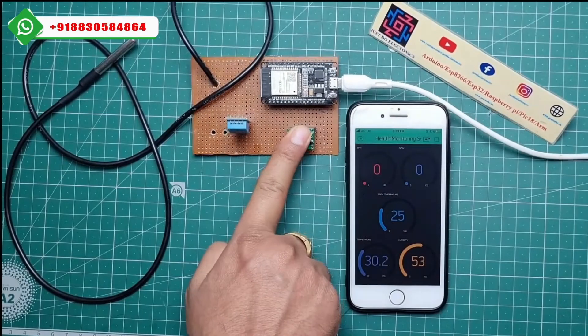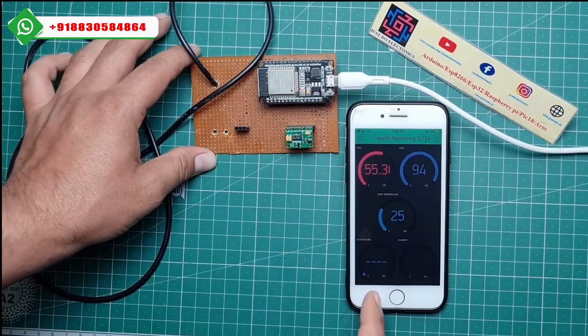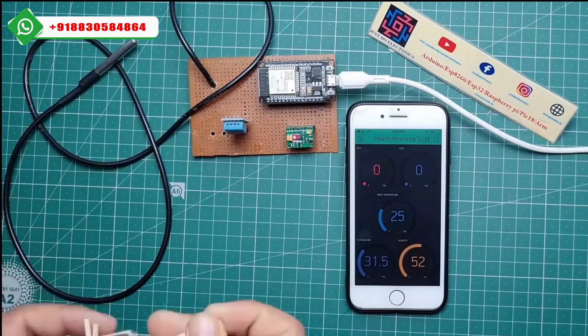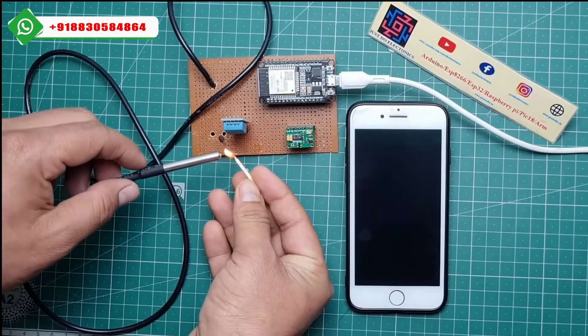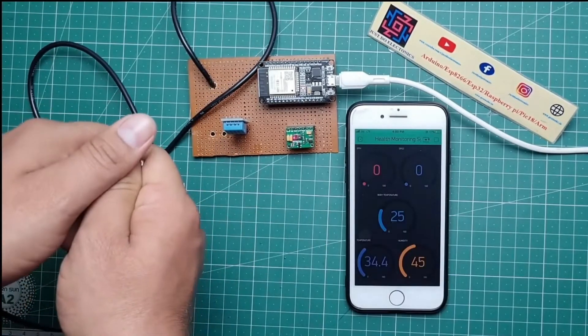This is the real-time data shown in the Blynk app. I just put this DHT11 sensor and I am providing heat near the DHT11 sensor, and you can see the real-time update in the Blynk app.